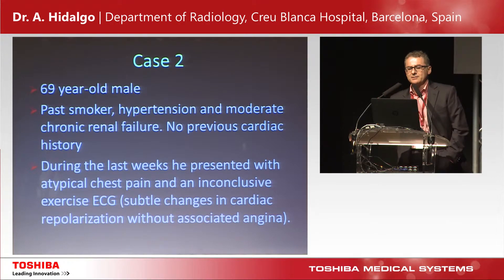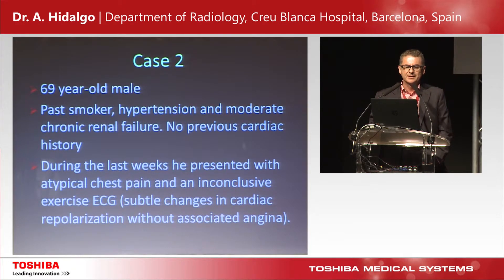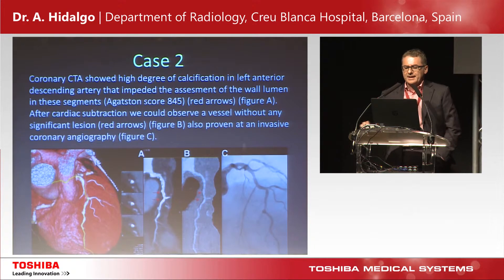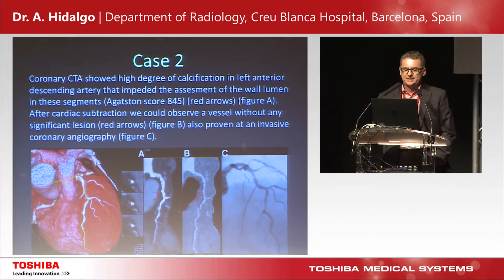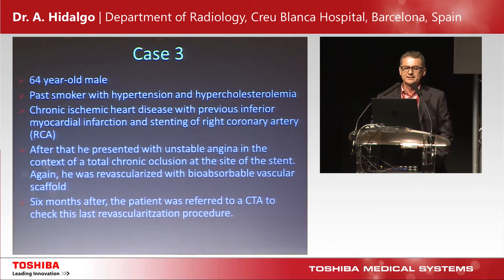The second case is a past smoker with cardiovascular risk factors who presented during the last week with atypical chest pain and an inconclusive exercise ECG — a situation that is quite frequent in real practice. When you perform the coronary CTA and apply the subtraction technique, you can see a plaque that could be difficult to evaluate. After subtraction, there is a good correlation with the invasive angiography, showing no significant lesions.